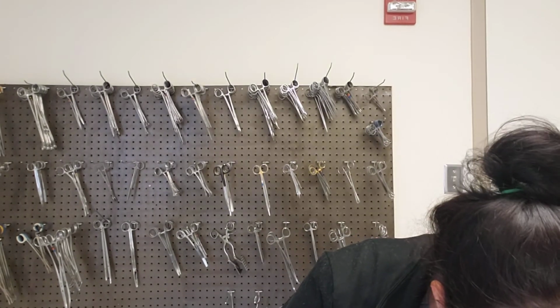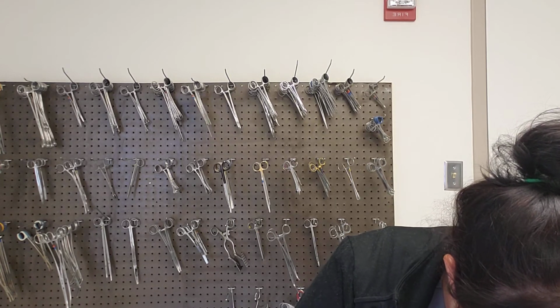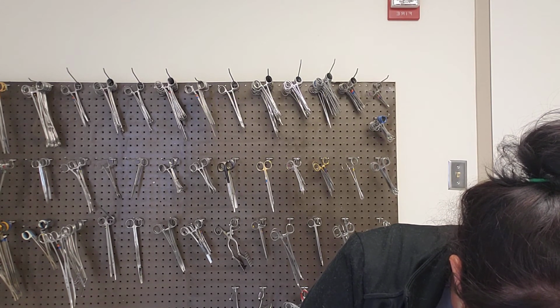And we can even get smaller. They even have micro instrumentation. There's Westcotts. I have these fun Castroviejo micro scissors. There you go. They're really small. Anyways, micro scissors.